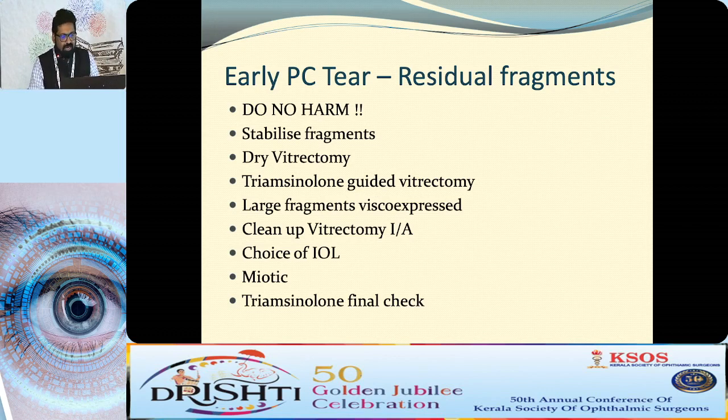The larger fragments can be visco-expressed. You should also do a cleanup vitrectomy. Don't stop with just removing the fragments. Try and remove as much of the cortex as possible using a vitrectomy IA switch. You can decide whether to implant an IOL or not.